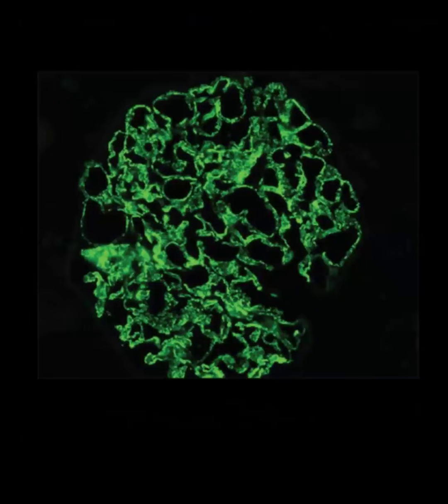So it is a type of granular deposits. You can see the granules. There can be fine granules if they are very delicate and very small, like gold dust. When the granular deposits are fine, that can be a different disease. And when the granular deposits are coarse, that can be a different disease.